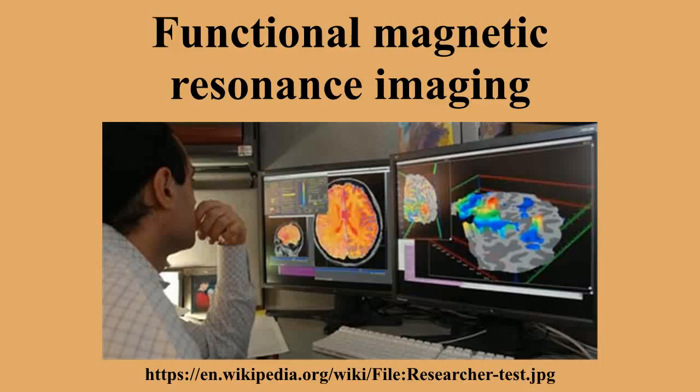Spatial resolution. Spatial resolution of an fMRI study refers to how well it discriminates between nearby locations. It is measured by the size of voxels, as in MRI. A voxel is a three-dimensional rectangular cuboid, whose dimensions are set by the slice thickness, the area of a slice, and the grid imposed on the slice by the scanning process. Full brain studies use larger voxels, while those that focus on specific regions of interest typically use smaller sizes. Sizes range from 4 to 5 mm to 1 mm.